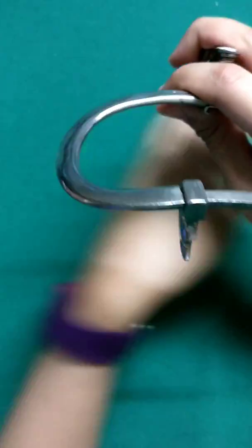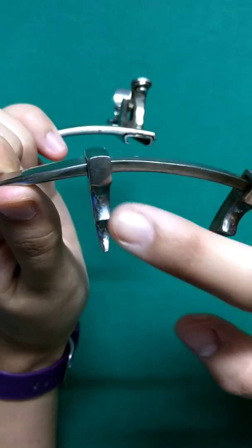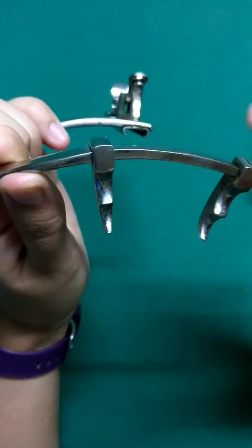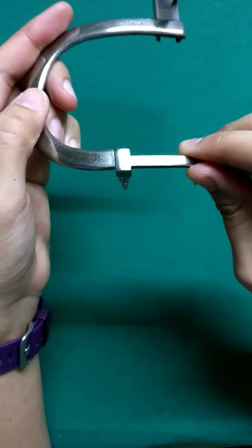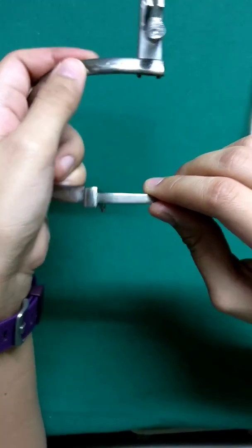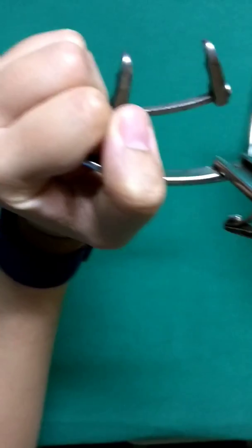There are two further clasps over here. This is for the upper lip and this is for the alveolus. Then only the frame will sit properly during the surgery and while insertion it has to be held in this position and inserted.